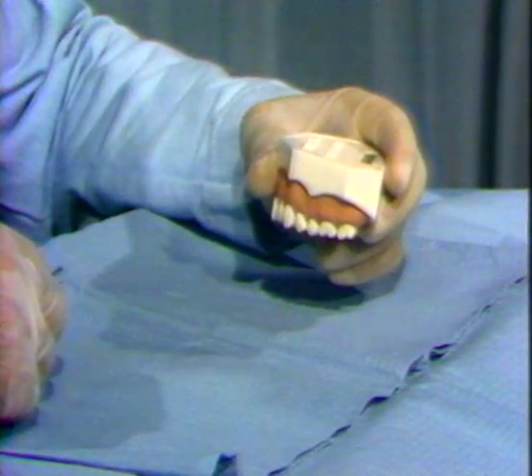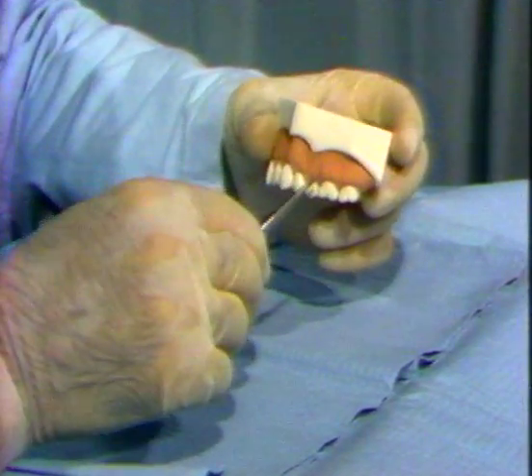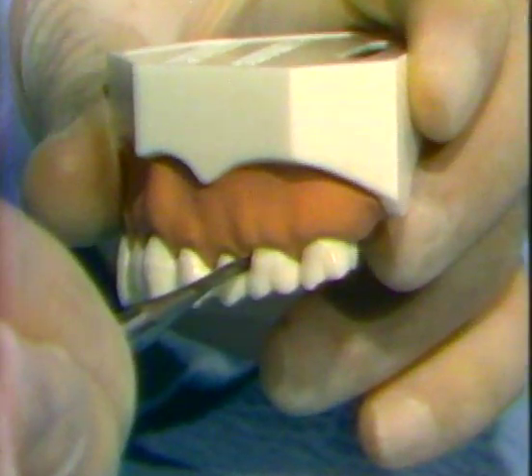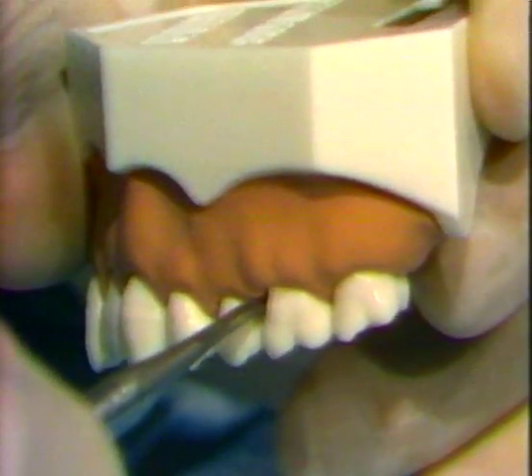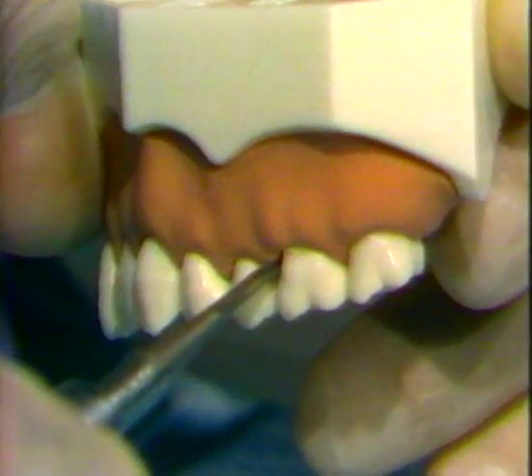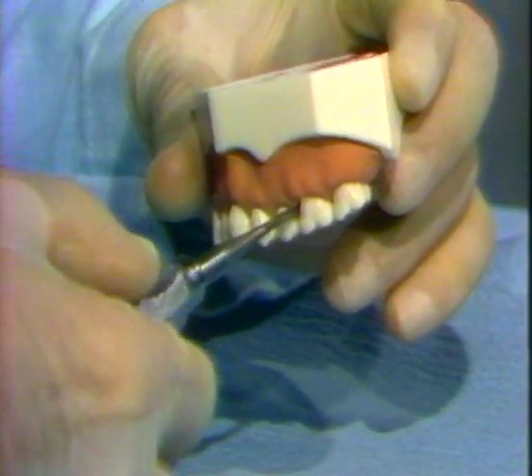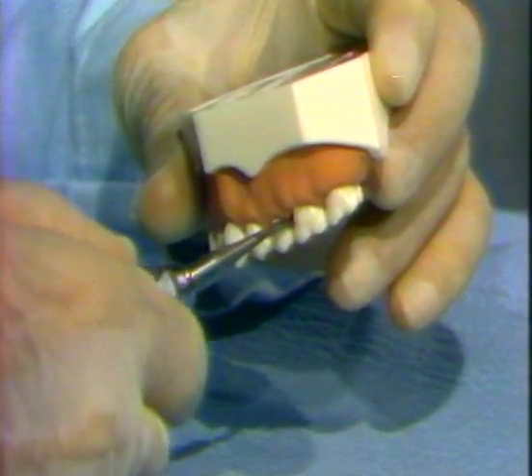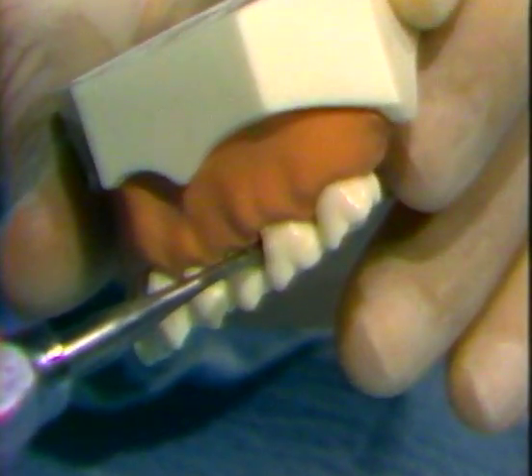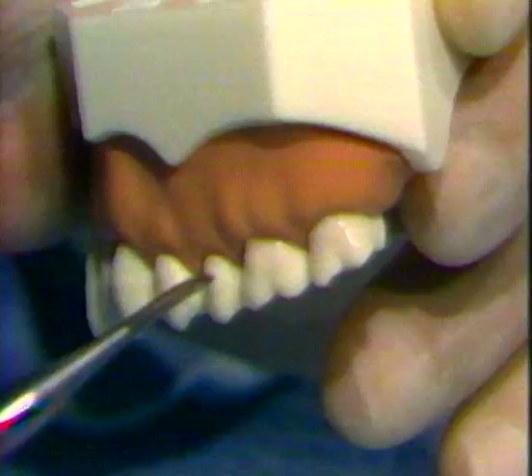The next instrument utilized is the number 301 elevator. The elevator is placed interproximally with the cutting edge against the tooth to be extracted. Pressure is then exerted against the tooth to be removed. The operator must avoid placing any pressure against the adjacent tooth if it is not to be extracted. The elevator is then rotated to bring the cutting edge of the elevator into the tooth to be removed in such a manner that the instrument rotates from the apex of the tooth toward the coronal portions of the tooth. When the tooth has been luxated, that is, moved and/or elevated from the socket, the instrument is laid aside.